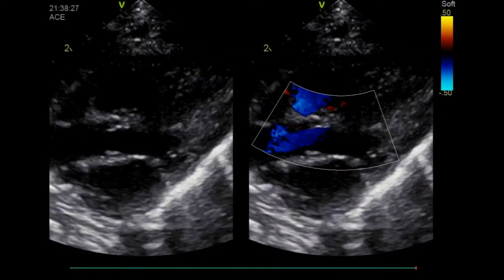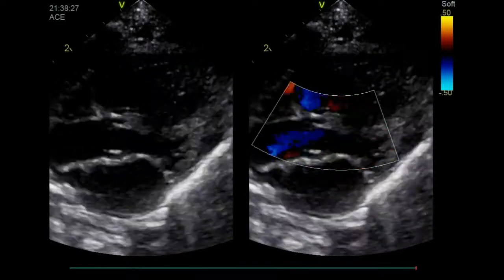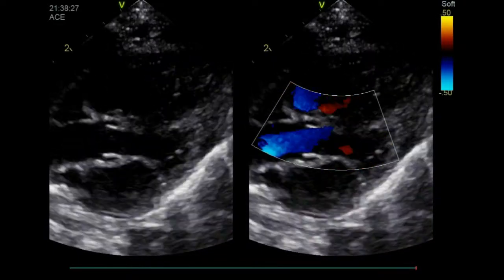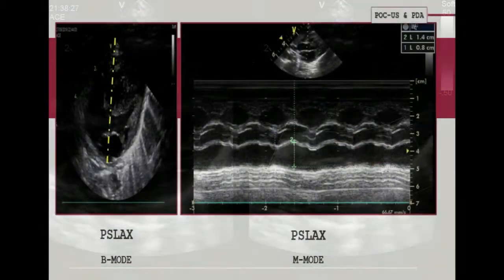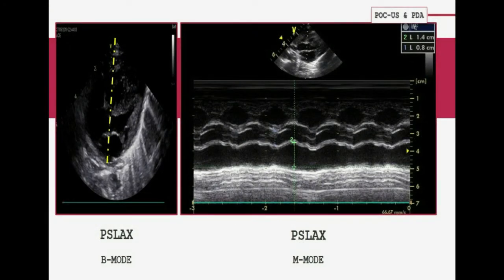Left atrium to aortic ratio is measured on the parasternal long axis view using M-mode. A cut is made in the left atrium at the level of the aortic valve, with the transducer placed perpendicular to it. The aortic valve is measured just before its opening, at the end of diastole, whereas the left atrium is measured at its maximal volume during systole.